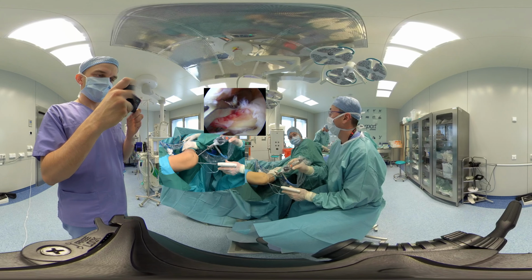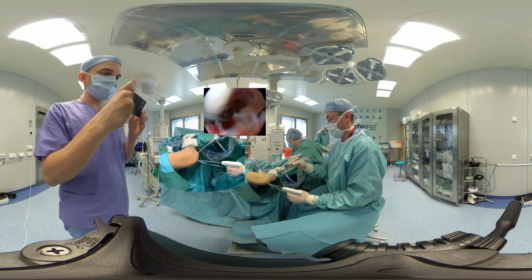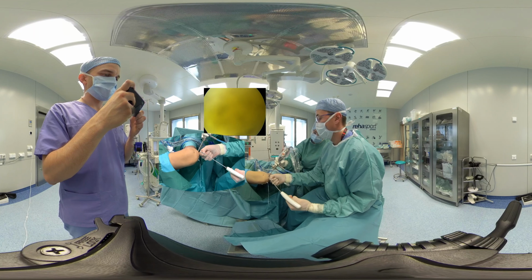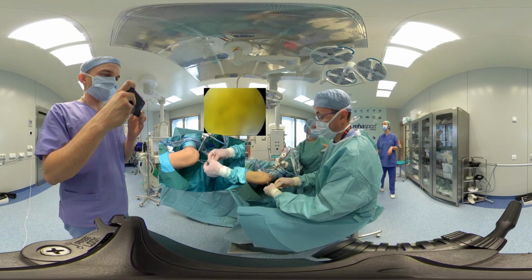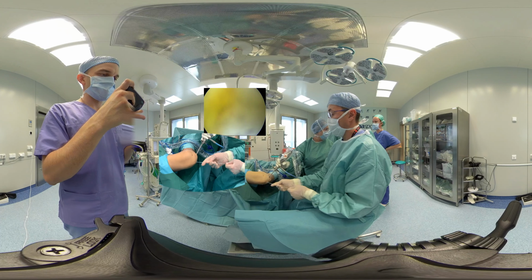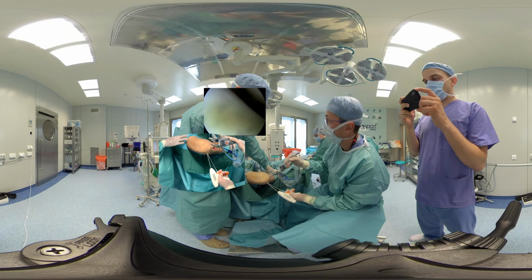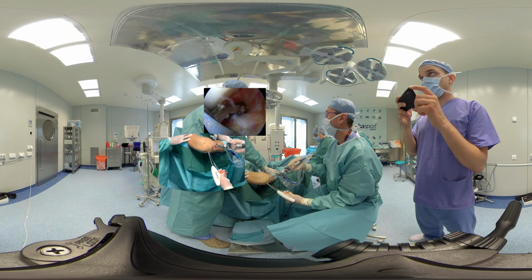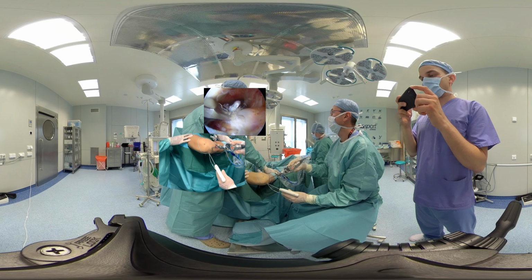We use the ultra tape to stabilize the meniscal root better. In the chronic lesion, the tissue is not of good quality and regular sutures may cut it. The tape stabilizes the tissue better. To be sure, we put on a double suture so that the damaged tissue is attached better to the bone.